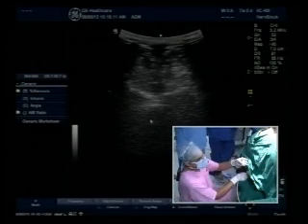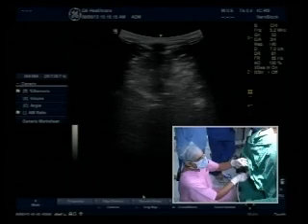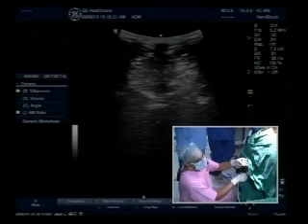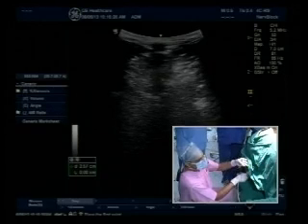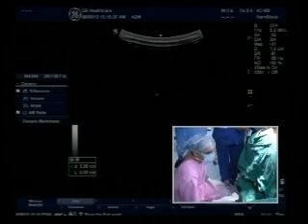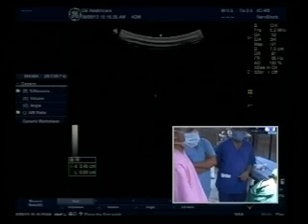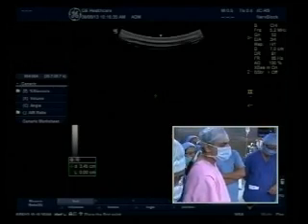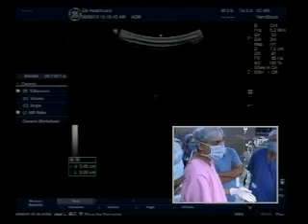Once again, I've got the picture here. It's in the center of the spine. Also, everything depends on the position of the patient, because if the patient moves or your ultrasound probe moves, then obviously the depth will be different, isn't it? What's your clinical experience? Does it correlate with the ultrasound depth, or does it vary? It correlates very well to the ultrasound-guided estimated depth, probably a couple of millimeters here and there. Say we found it at 3.44, I probably will find it between 3.4 to 3.5.